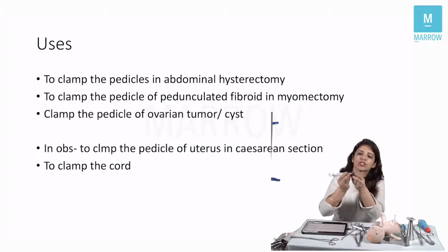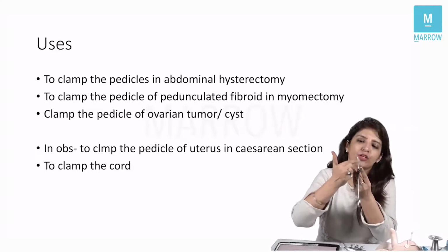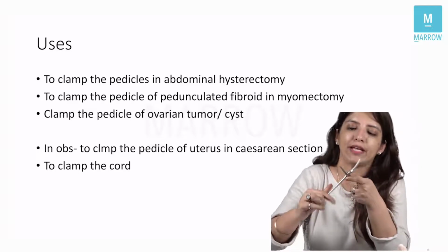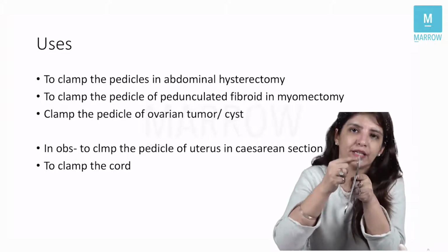forceps. Mangot's forceps, one side has a longitudinal groove, the other side it has a longitudinal bar, right? This longitudinal bar will fit into the longitudinal groove on the other side. So one blade will have a longitudinal groove, the other blade will have a longitudinal bar, right?